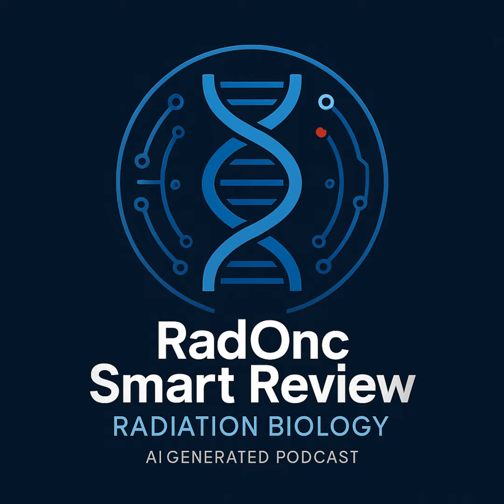Okay, so let's tie this all together. Thinking about clinical decision-making, how has all this molecular imaging truly changed things in radiation oncology? What's the relevance for practice? Oh, it's been completely transformative. I mean, fundamentally, the CT scan is the absolute foundation of our treatment planning process. Can't plan without it. Right. It gives us that 3D anatomical model. It's how we delineate everything, the GTV, CTV, PTV, all the organs at risk. And using CT contrast helps us see those boundaries even better.